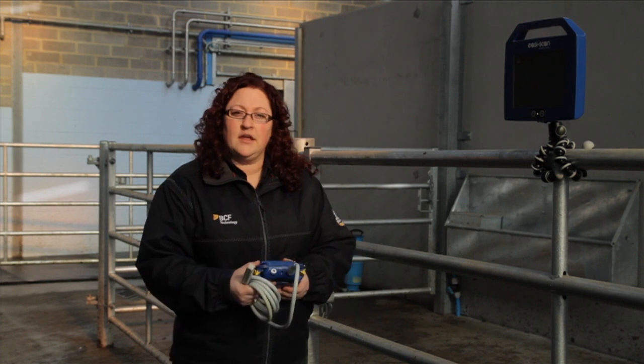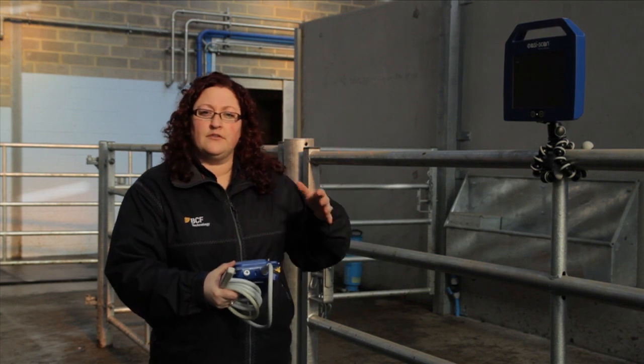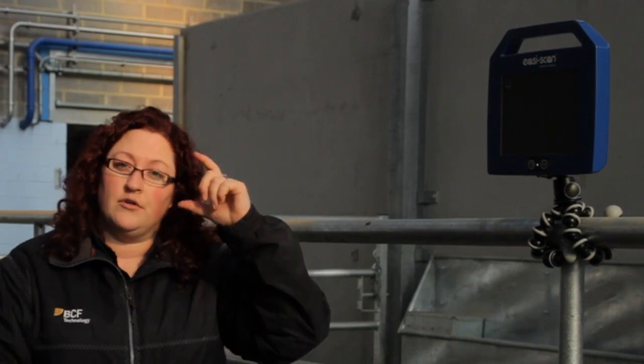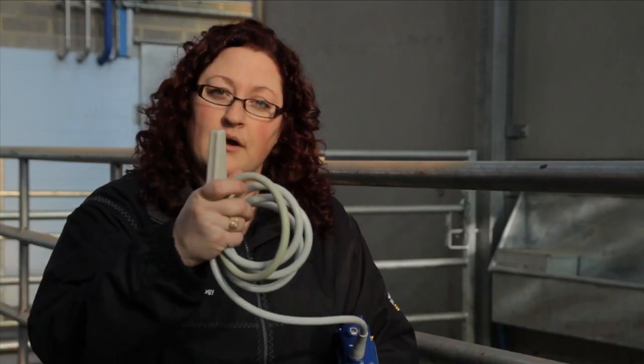When preparing to get scanning, the first thing that you need to look at is the machine that you're using. There are various types of machines that are available to perform an ultrasound examination in cattle. This particular machine has the console and the probe, which is attached. The viewing device, so what you actually see the image on, is either an external monitor or on a set of goggles. There's also a wrist display. On other machines, these may all be combined into one console. Some of them may be more stationary, while this one you can wear on your hip and walk around with you. You also have the probe, and this is what actually acquires the image.